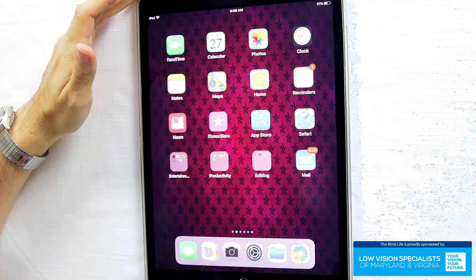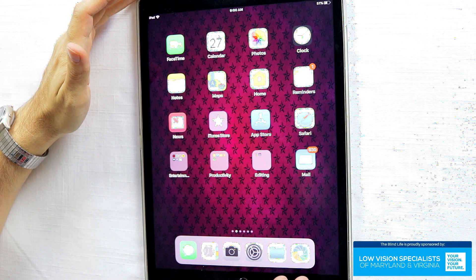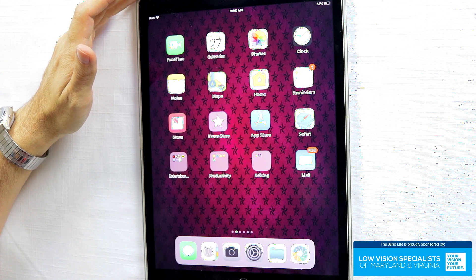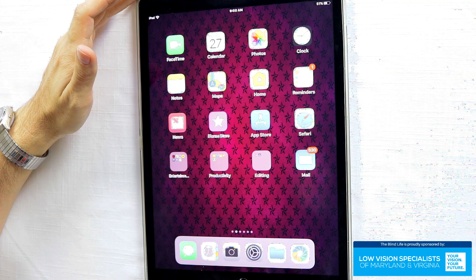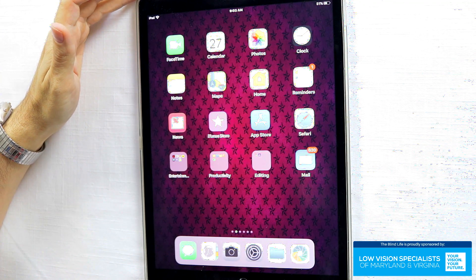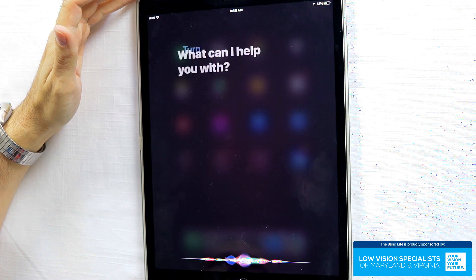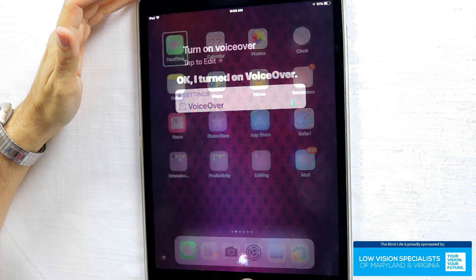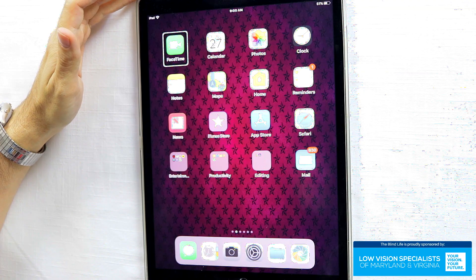So when you first get your device, you're probably not going to be able to see it. You're not going to be able to see the settings to go in and change them. You can either have somebody help you change all the settings, or what I always do is just go ahead and turn on VoiceOver. The easiest way to do that is to have Siri do it. Turn on VoiceOver. Okay, I turned on VoiceOver. VoiceOver is on. Now we're going to be able to change all of our settings.